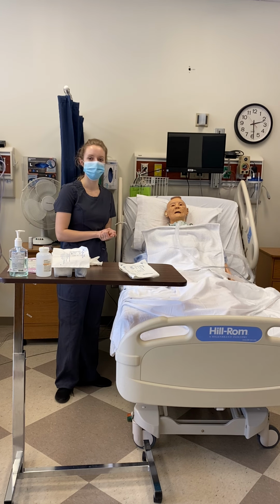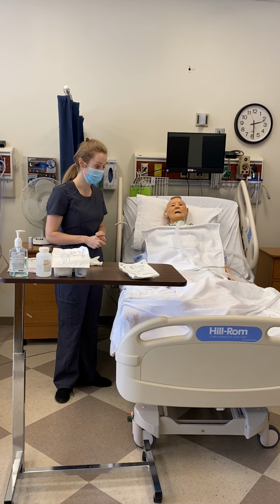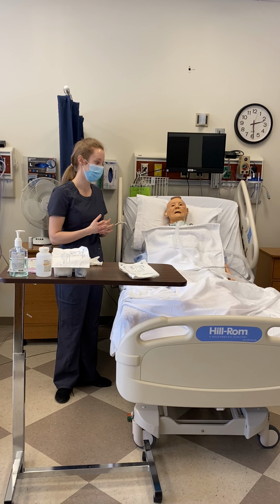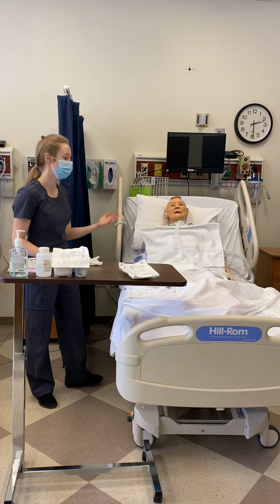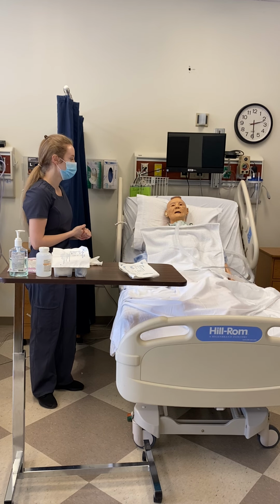I want to establish a non-verbal form of communication in which Mr. Smith can let me know if he's feeling distress. In this case, I'll have him raise his right hand, and so I will know to stop the procedure at that point. He is in high Fowler's, hyperoxygenated, towel across his chest, and I will now perform an assessment to rationalize why Mr. Smith needs suctioning today.